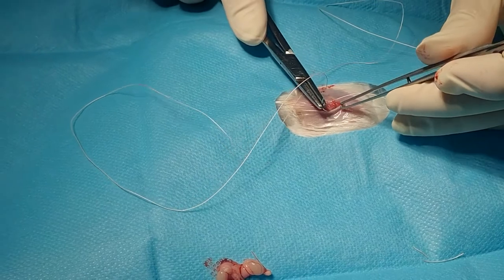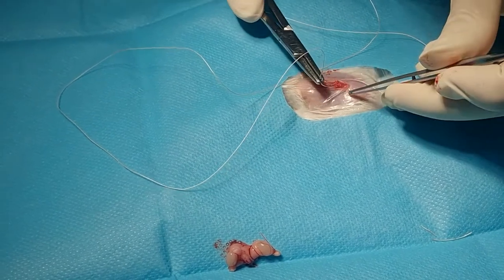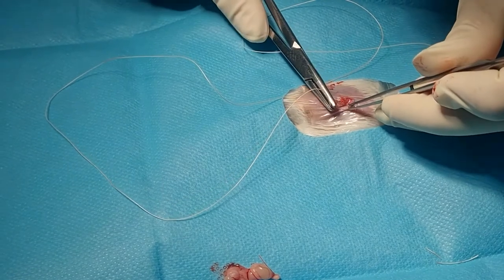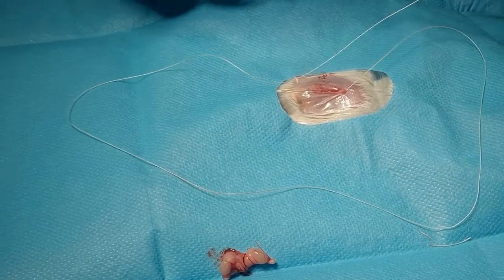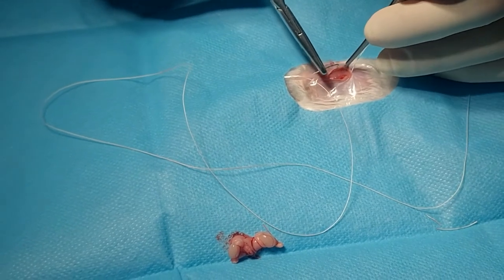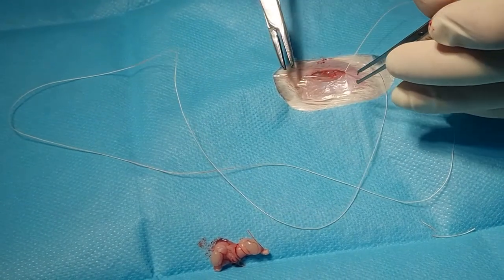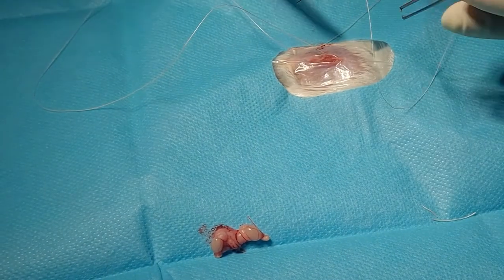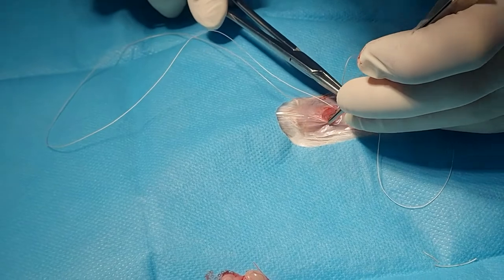I've recently changed my technique — rather than doing a linea alba, tying that off fully, and then starting again to do the subcutaneous layer, I'm just continuing on. The difficulty is I'm right-handed and not very good stitching left to right. So going forward, I'll probably do my linea alba the other way round, because it's a lot easier for me to do a subcuticular pattern working from the caudal end of the wound cranially. Now, if this was a bigger animal like a rat, I'd probably do a subcut and then an intradermal layer. But with mice, because there is so little tissue and it's really really thin, I actually avoid doing an intradermal layer and just do a subcuticular pattern and then glue.